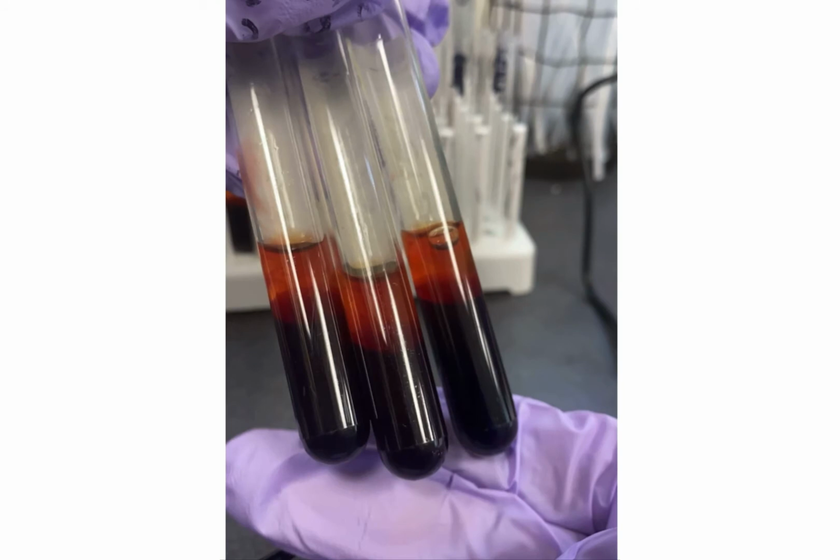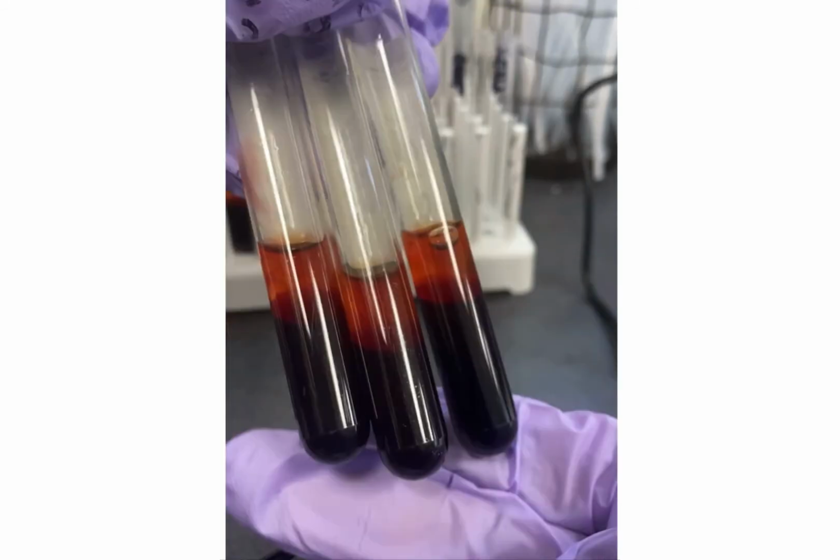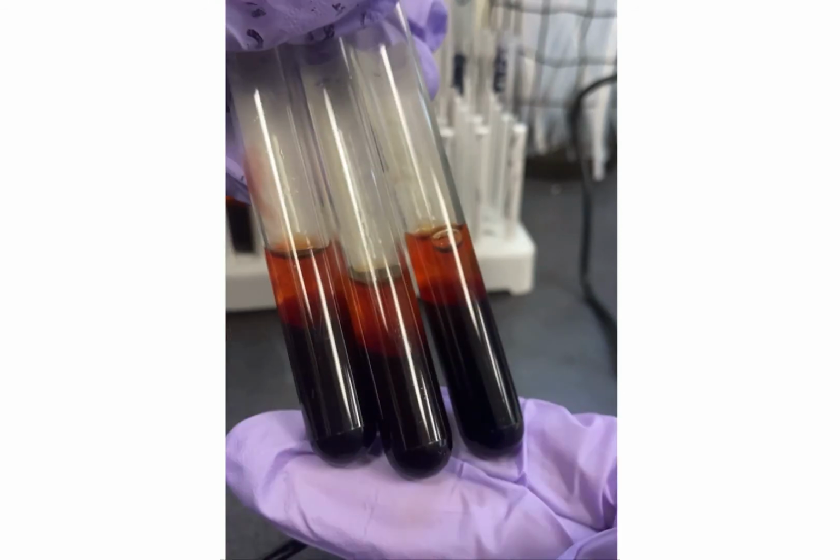So in this image, you see the donor reagent red blood cells at the bottom, and you see the patient plasma at the top. The patient plasma theoretically contains an antibody, let's say a warm autoantibody. The reagent donor red cells will theoretically remove the warm autoantibody when the antibodies attach to the red cells. We will then have a plasma with the warm autoantibody removed.